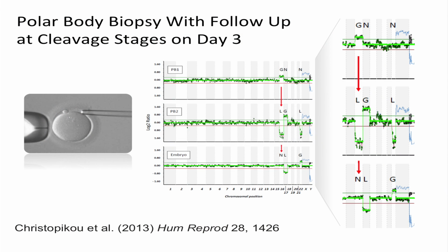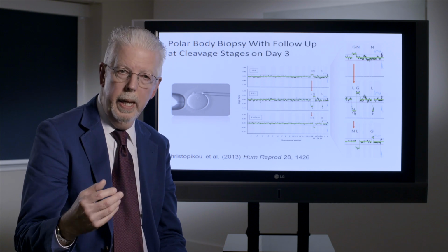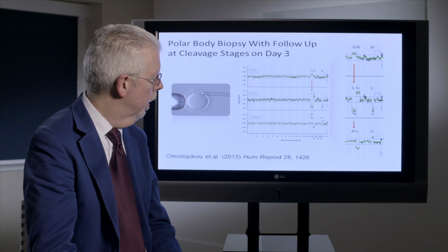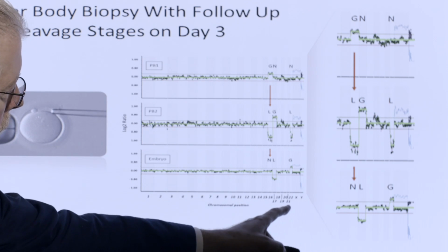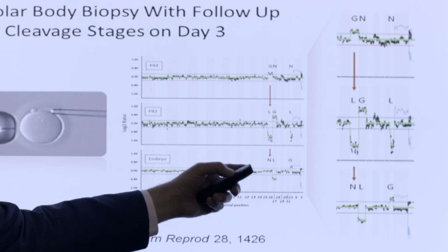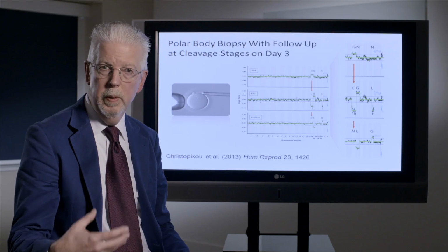We now know that actually, because of the mechanisms of meiosis that I don't have time to go into in detail, we need to analyze both first and second polar body to get an accurate idea of whether an abnormality that we pick up in the polar body is going to translate into an abnormality in the fertilized oocyte. And what we see here is an array CGH plot. From the left to the right here, we have chromosomes 1 to 22, the X and the Y chromosome. And we have here the green line, which indicates this ratio from the array CGH. For all of these chromosomes, there's an equal amount of red and green. And so these are all euploid.